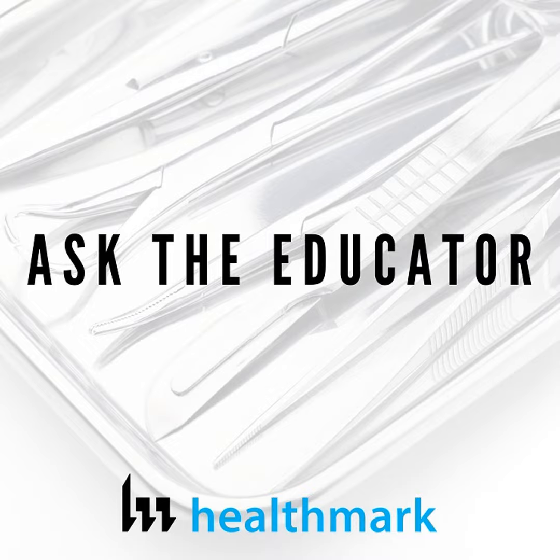Well, AIUM is just a society, which is at the lowest rung of external guidance, and above that you have AAMI, TJC, CDC, and way above everybody is federal guidance, and the cornerstone of everything is Spaulding. So to go against everything is a very, very peculiar position to be in medically. I've not quite understood it.